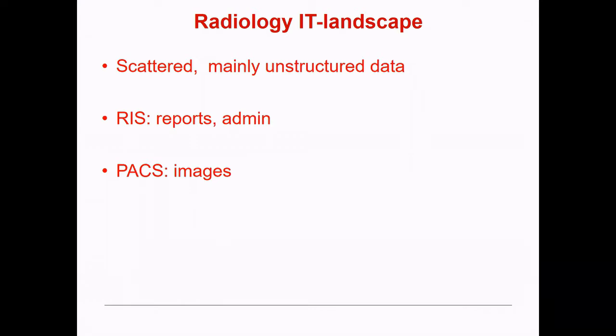I had to learn that there are 4 levels of structured reporting, and the first 2, to me, are still extremely unstructured, and we are hardly at level 1 or 2, and we're not doing very badly. Basically that means you have a flat text that states which organ group or region is being reported, and that's the way it is separated out. But it means if you're really looking for some specific information, it is in an unstructured piece of text.